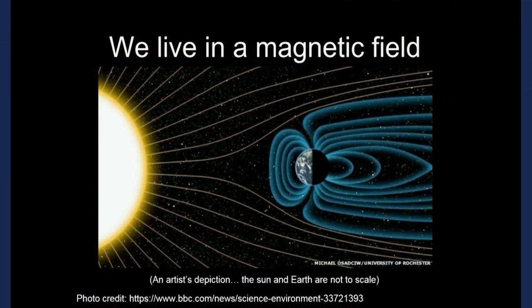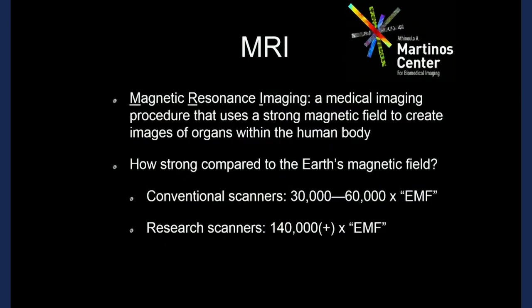Some people are kind of scared of magnetic fields. Well, don't be. You're in one right now. The Earth has a magnetic field. You were born in a magnetic field. We live our lives in a magnetic field. The difference is the magnetic field in one of these MRIs is much, much stronger. How much stronger?